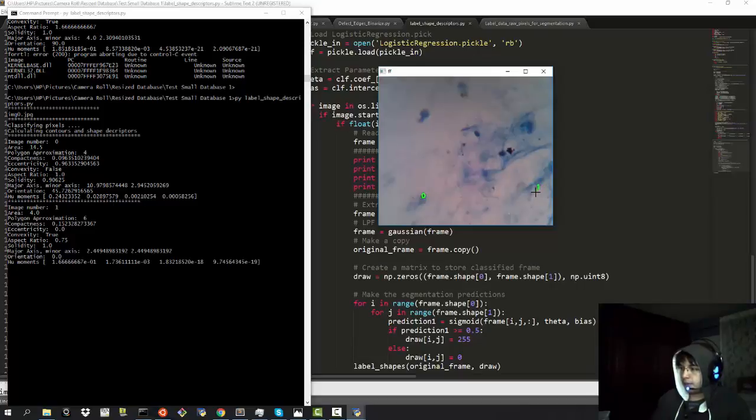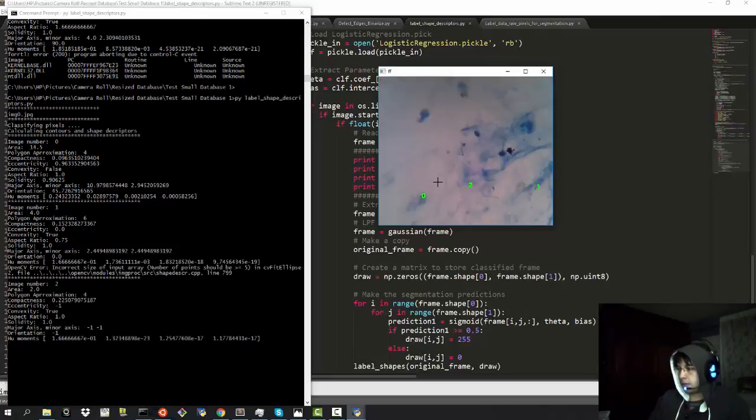This segmented object that we have detected over here is not a bacilli, for these reasons. In the first place, the area of the object is incredibly small. You cannot expect to have tuberculosis bacteria with this size, because in reality the bacilli has a length of 1 to 10 micrometers, and compared to pixels that scale is 50 to 80 pixels, but in this case it is 4, so it's more likely to be some fuchsine debris. So that's not a bacilli object. We pass to the next one.